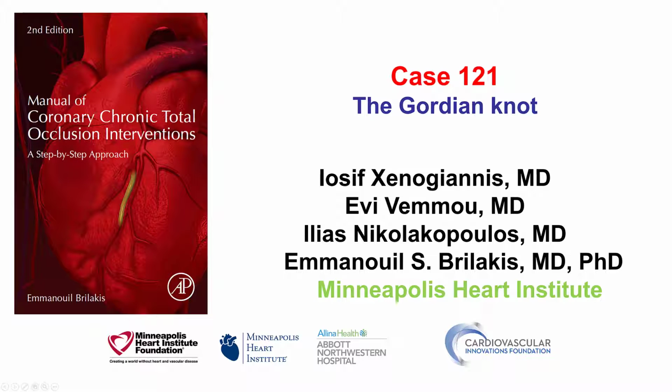Hi, this is Manos Brilakis from the Minneapolis Heart Institute and the Cardiovascular Innovations Foundation, presenting case 121 for the Manual of CTO Interventions. This is a case entitled the Gordian knot, for reasons that will become apparent shortly.